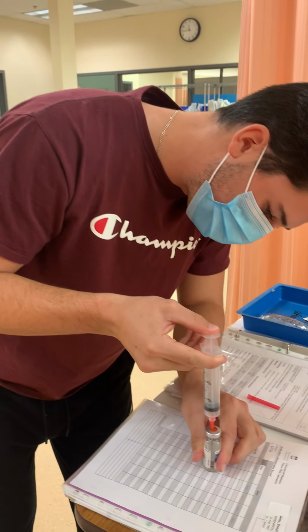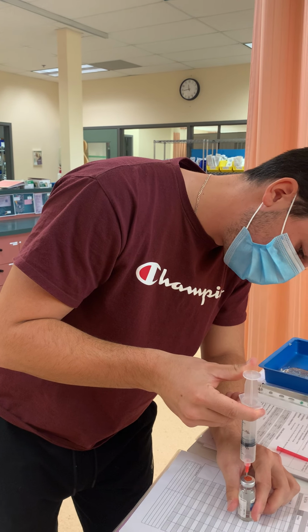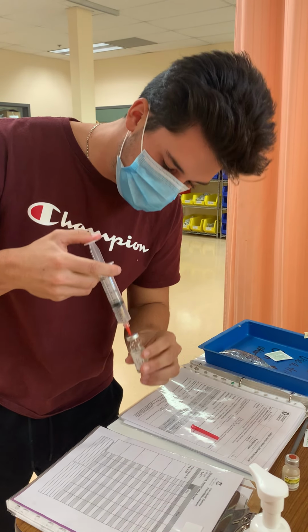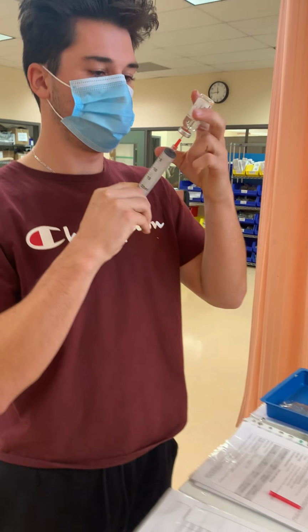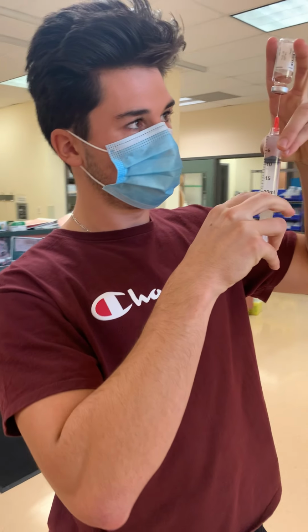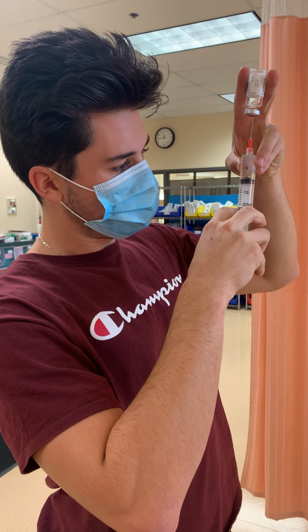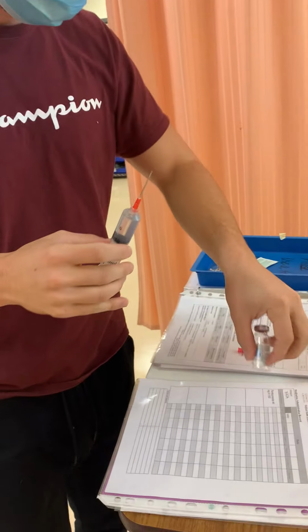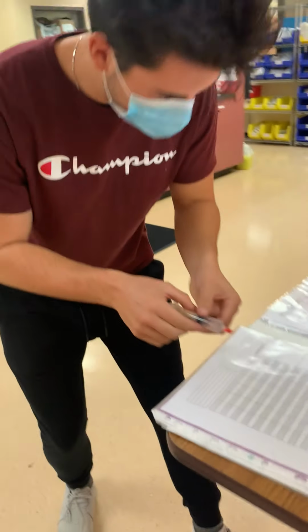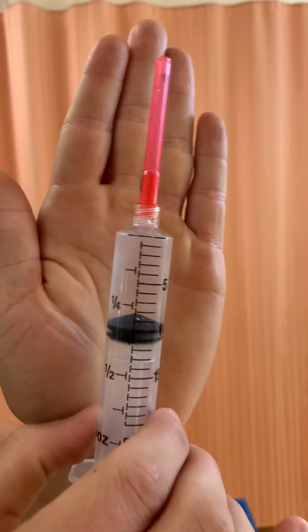So I'm going to inject it into my medication, and then let my air come up. I'm going to pull up my 10 mLs. So now I can see that I have my perfect 10 mL dose. I can go ahead and recap it, ensure that there are no bubbles, and I see that I have my exact 10 mL dose.